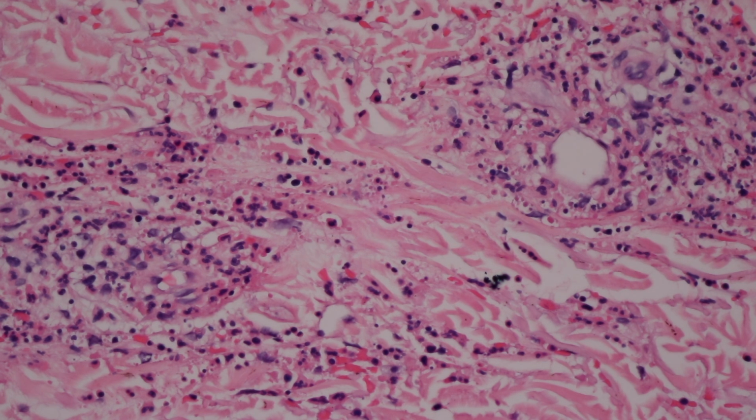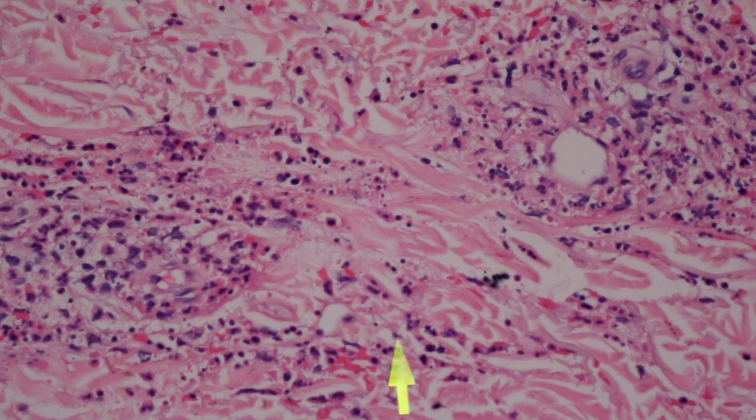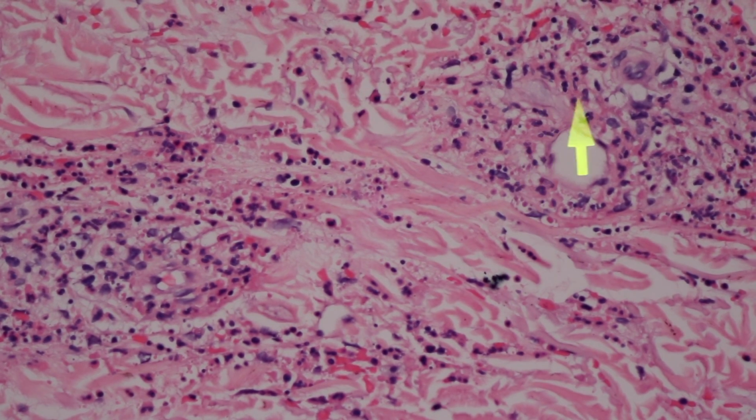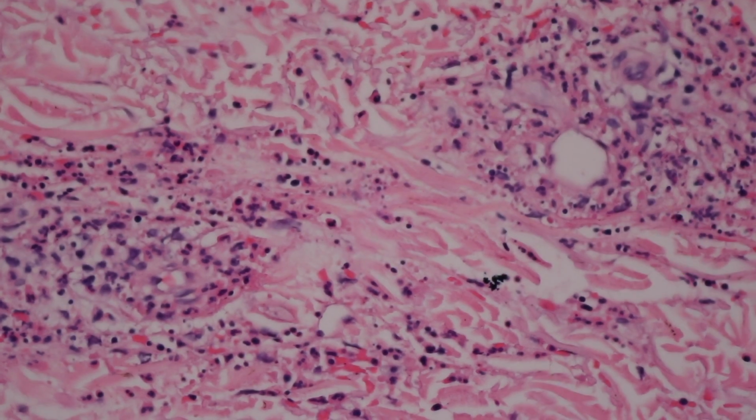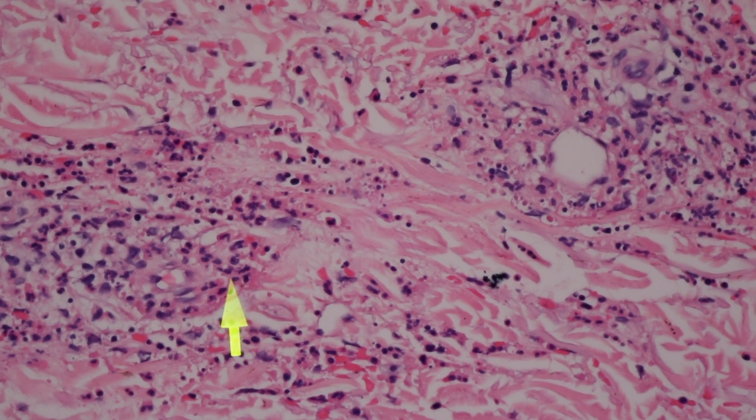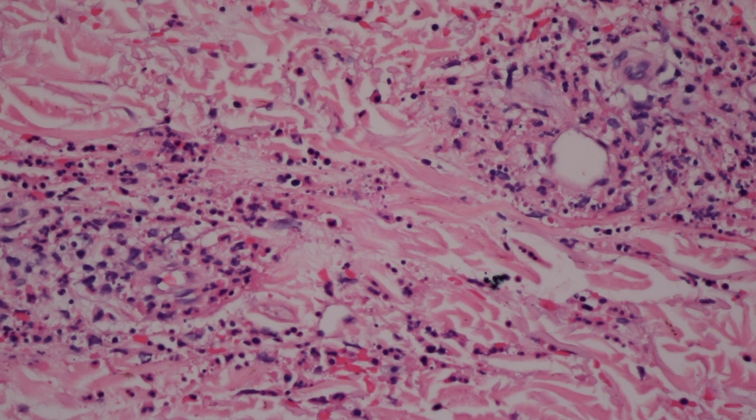So that's one feature, to see neutrophils around the vessels, and another feature is to see the presence of debris, and the third feature is to see damage of the vessel wall. And that can come in two forms, either fibrin in the vessel wall or necrosis. And sometimes it's hard to tell fibrin and necrosis apart, and so we use terms like fibrinoid necrosis of the vessel wall to describe that. But all this pink material that's kind of amorphous that you're seeing here in between the neutrophils wrapping around the vessel, that's fibrin. So fibrin deposition in the wall of a vessel, I find that really useful, as well as the nuclear debris.